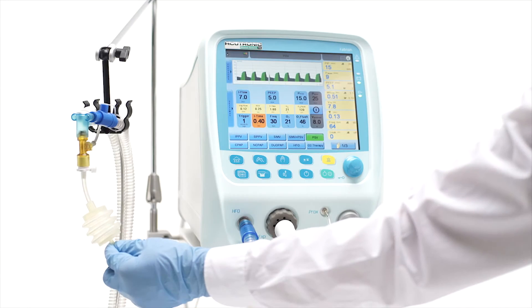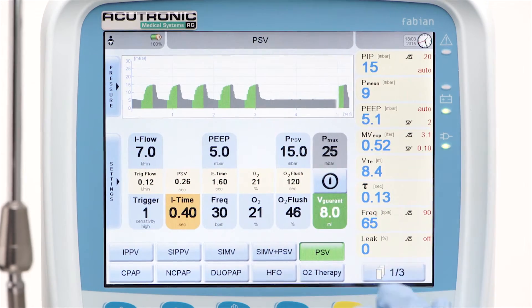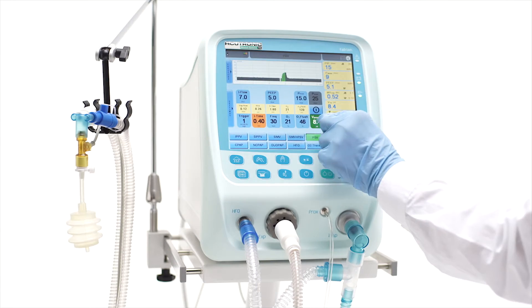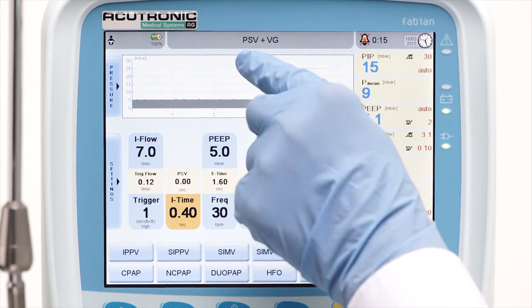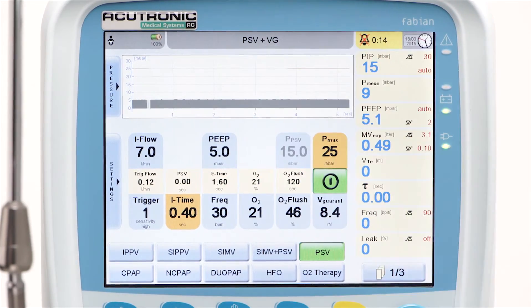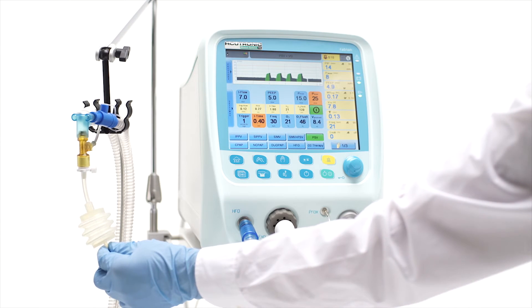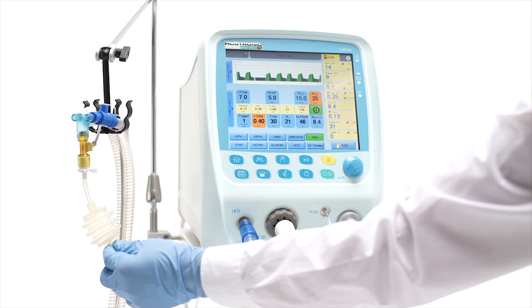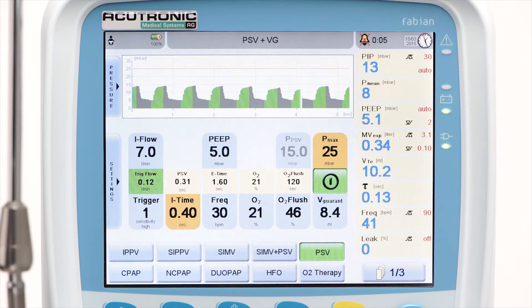Volume guarantee can be combined with PSV, and PSV plus VG will be displayed in the status window. With VG combined with PSV, the assisted pressure level may vary according to the lung mechanics and the patient's demand, and can be evaluated in the numeric block of measurements.